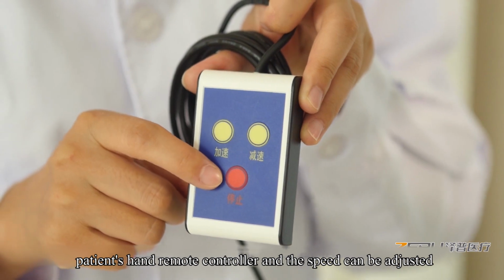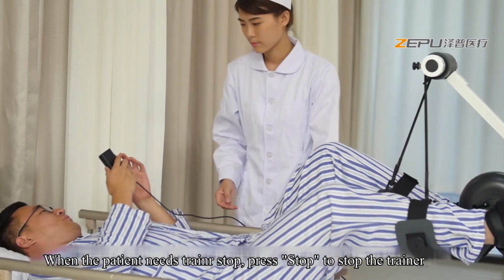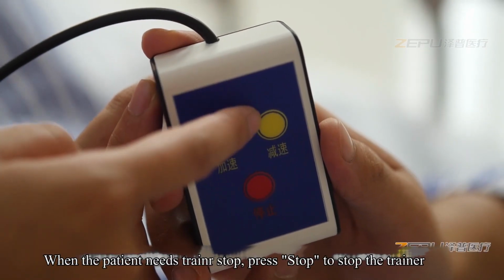Nine, patient remote controller. The patient holds the remote controller, and the speed can be adjusted. When the patient needs the trainer to stop, press the stop key to stop the trainer.